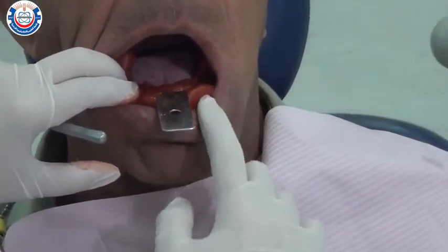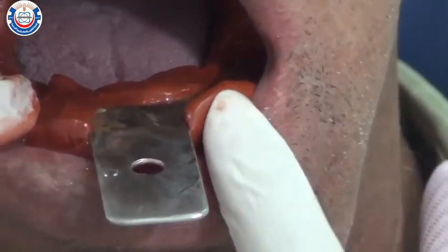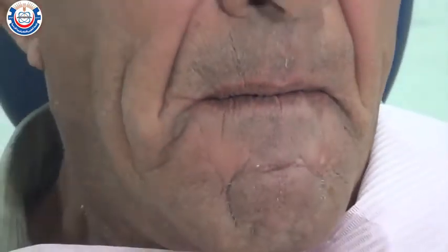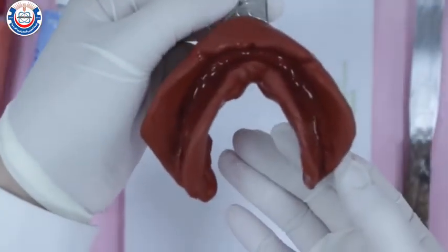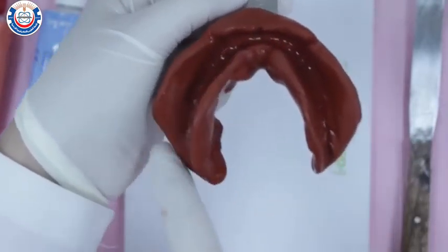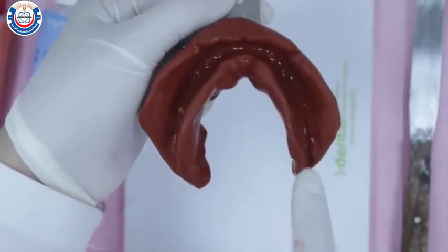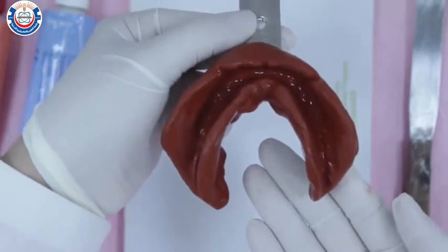Note that the outer surface of the impression is now fully rigid. To remove the impression, gently break the seal around it and remove it from the patient's mouth. Dry the impression and inspect it under a good light source to make sure you've recorded all anatomic landmarks: the full depth of the labial and buccal sulci and frena, the buccal shelf area, the retromolar pad, the lingual sulcus, and the lingual frena.